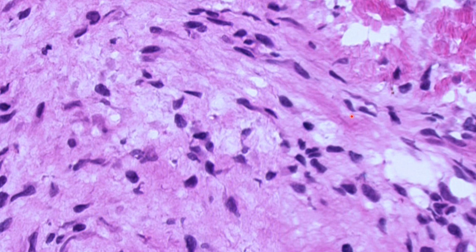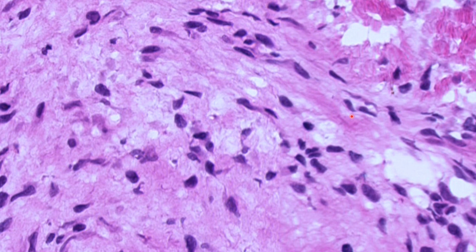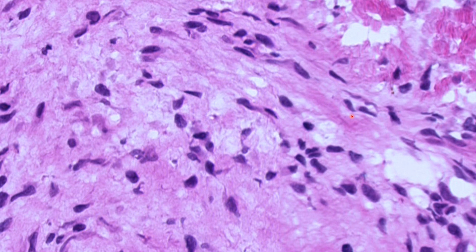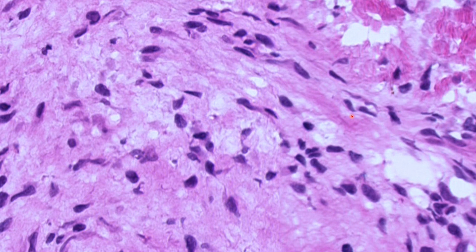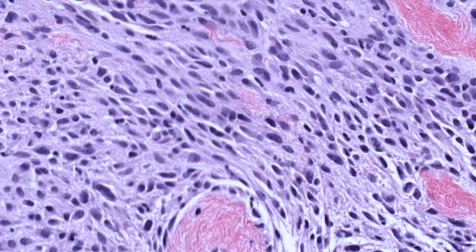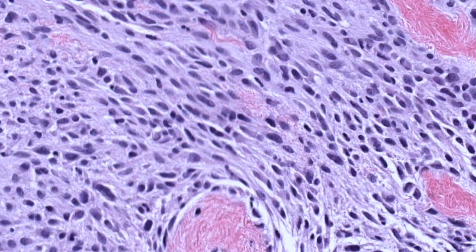A plump nuclei with a blue projecting tail surrounded by pink cytoplasm — that's how a myofibroblast looks. Myofibroblasts are seen in the majority of healing tissues: nodular fasciitis, proliferative fasciitis, and myofibroblastomas. So you need to know how a myofibroblast looks. A fibroblast has very thin wavy nuclei with lots of fiber surrounding them; a myofibroblast has a plump nuclei with a bluish extension from the nuclei surrounded by pink cytoplasm. This image is from a myofibroblastoma case.